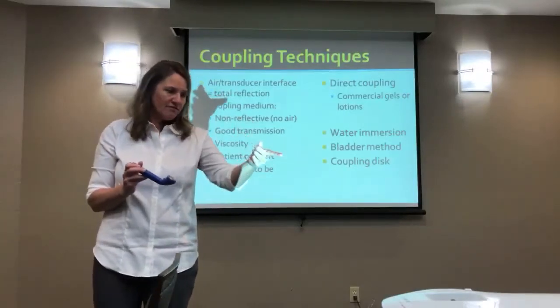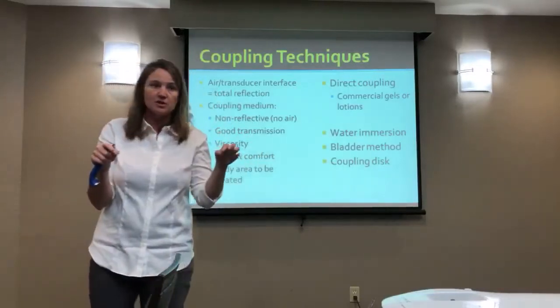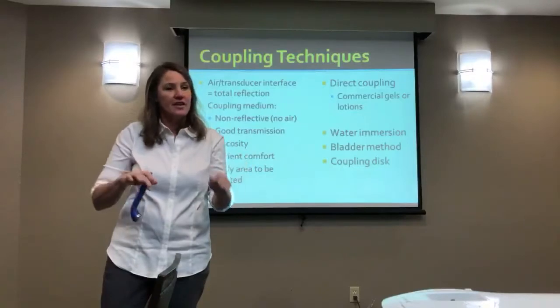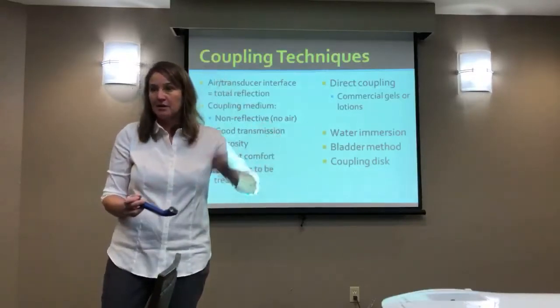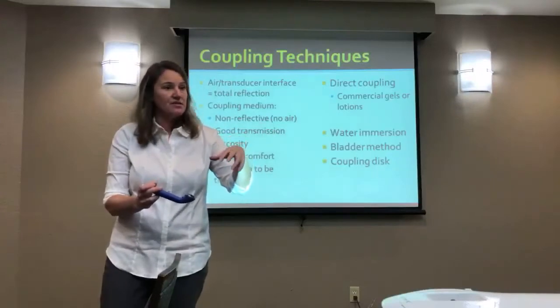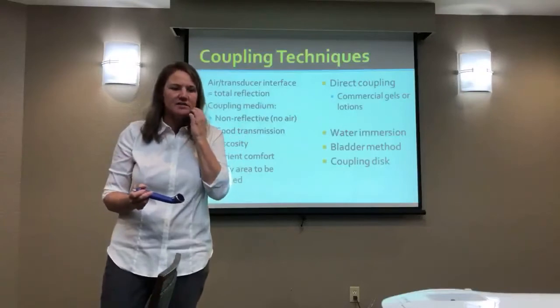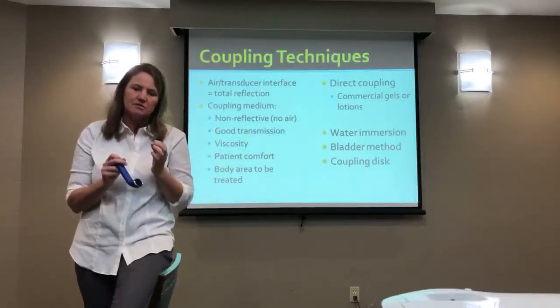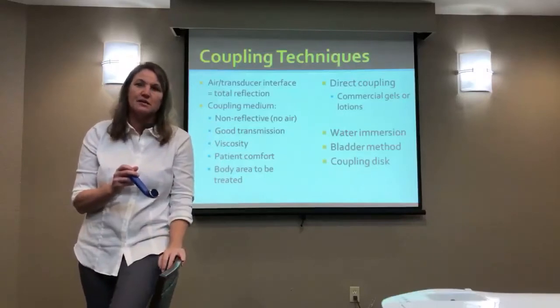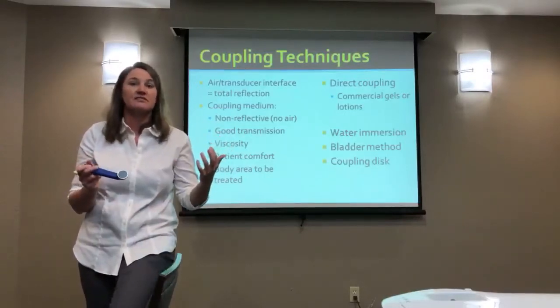And then I took one of my containers that had the e-stim electrodes in it, and we filled it with water, and we put it in, and I said, well, you see, that's what it should look like. So it went right through that baggie, through the water, and you could see it reflecting off the surface. And it seemed pretty unimpeded, but that was just to the naked eye. So if you're using any kind of a medium to better transmit, make sure it's actually doing that and not somehow making it even less effective.